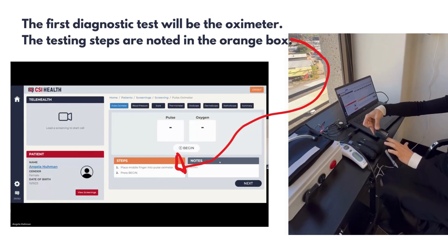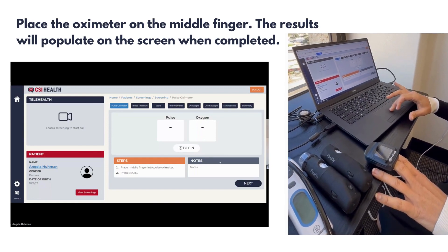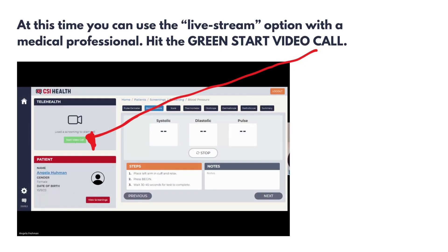Testing the blood oxygen level, the oximeter can be placed on the middle finger of the student or patient. At this time, you can note the start video call, which is the green button.